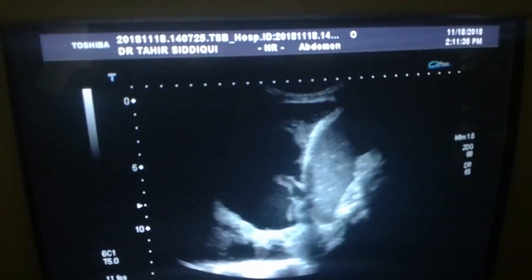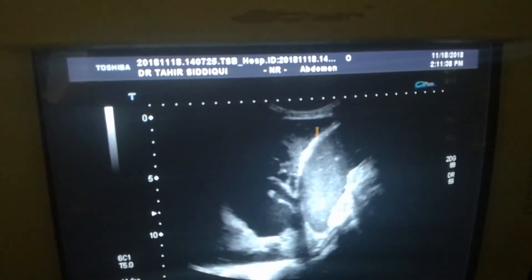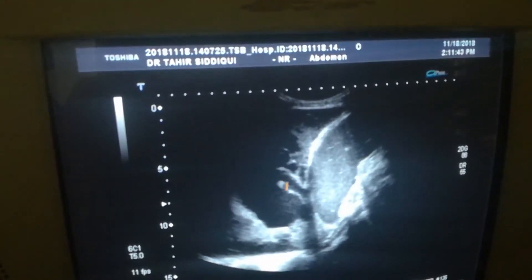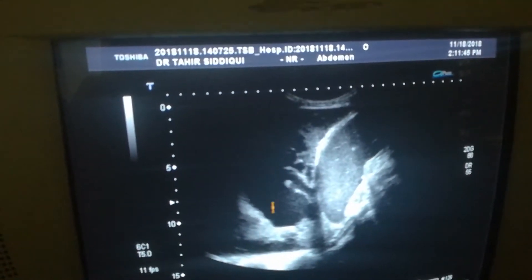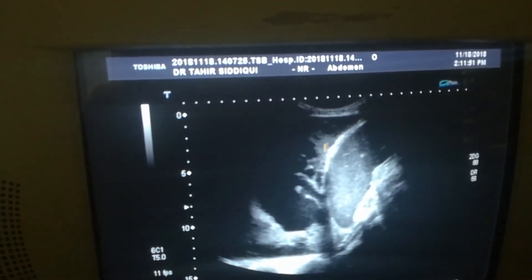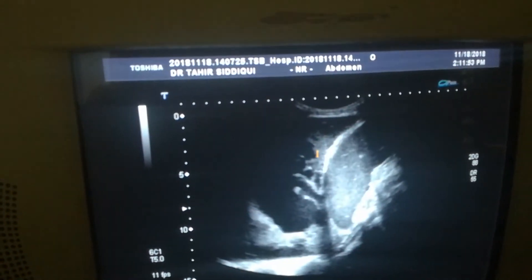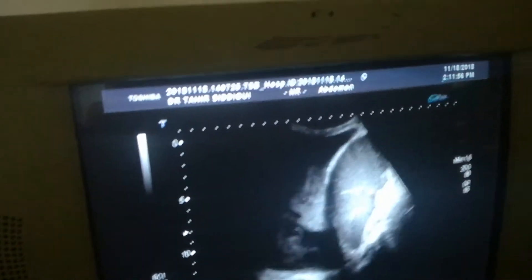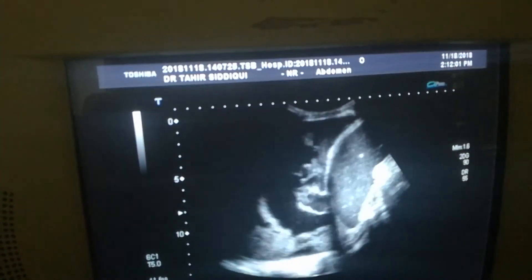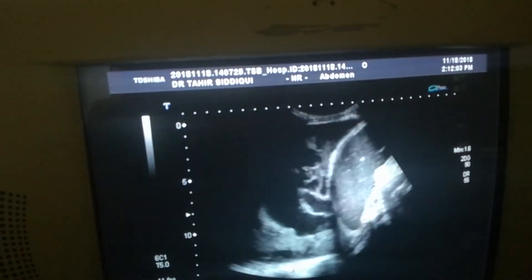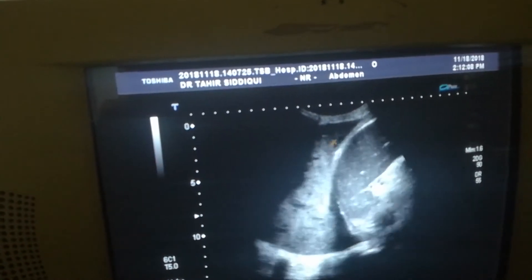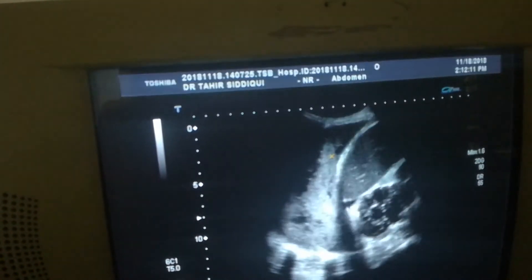This is the suprarenal area and this is the left pleural space. In this space, you see a moderate amount of fluid with debris and thick septa. Here we see thick islands of echogenic material, and the dancing lung tissue as well within it. This is the lung tissue and this is the echogenic material.